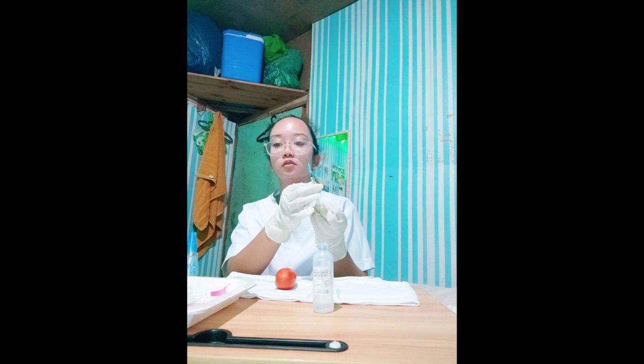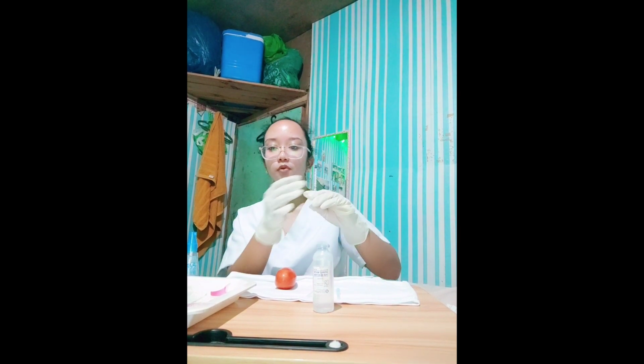So now I will use the ulnar side of the non-dominant hand to pull the skin approximately 2.5 cm, and we will hold the syringe between the thumb and the forefinger of the dominant hand. Inject the needle quickly and firmly at a 90-degree angle.